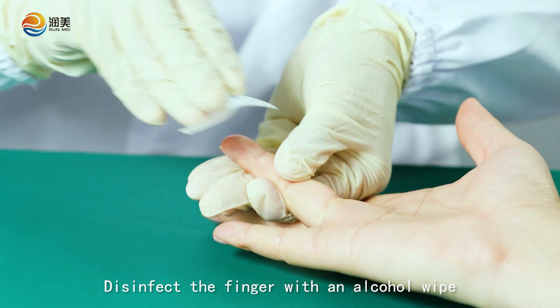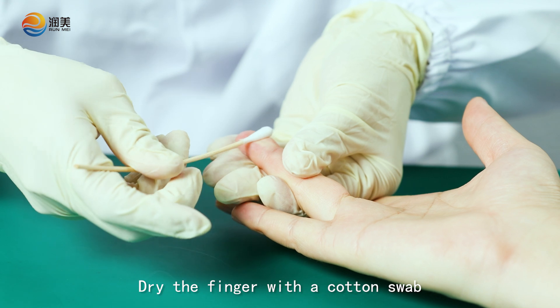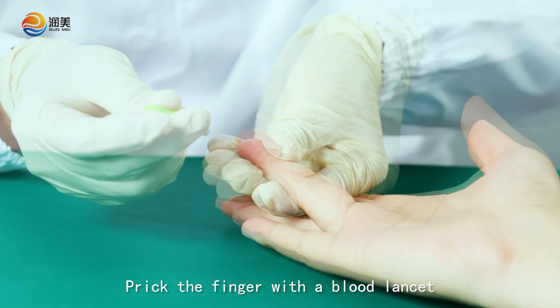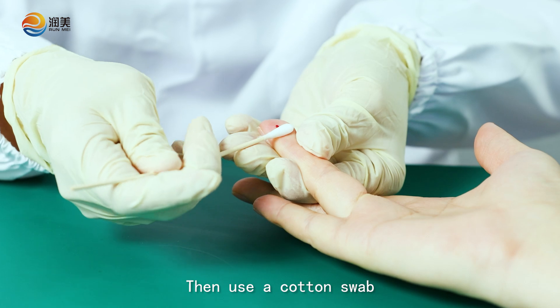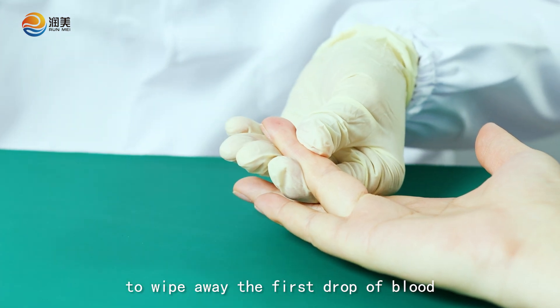Disinfect the finger with an alcohol wipe. Dry the finger with a cotton swab. Prick the finger with a blood lancet. Then use a cotton swab to wipe away the first drop of blood.